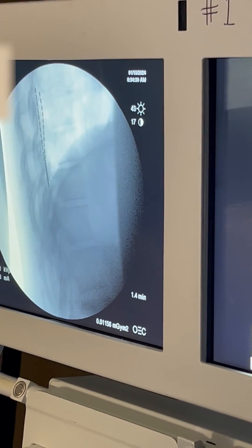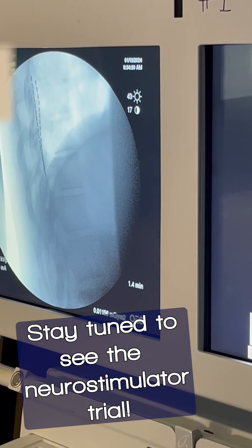Now we're going to show you the lateral posterior view. This patient has some scoliosis, so there's a little parallax — they are posterior in the canal.